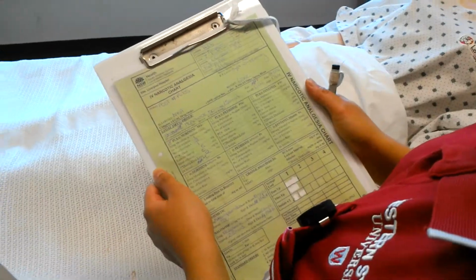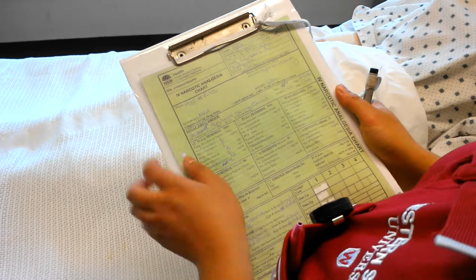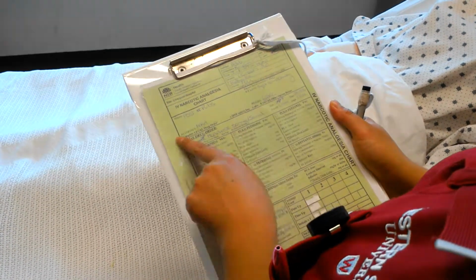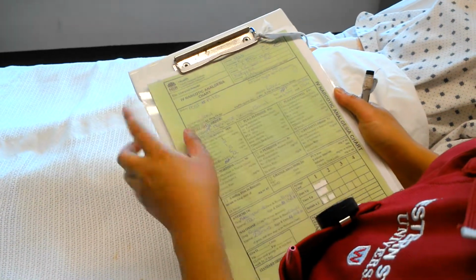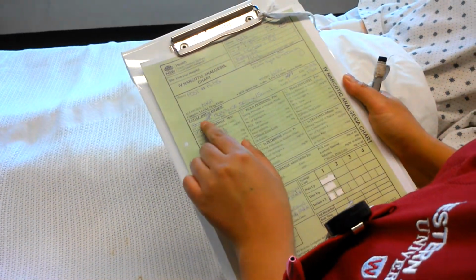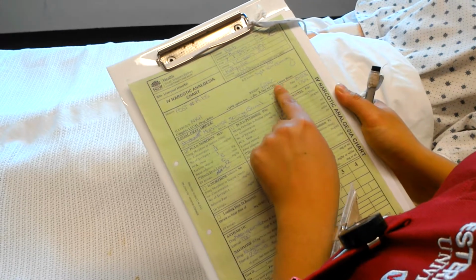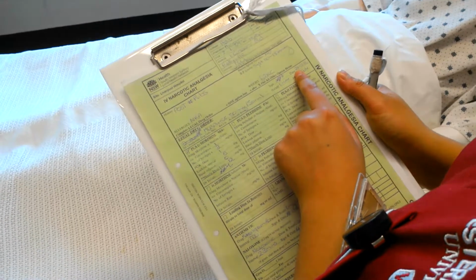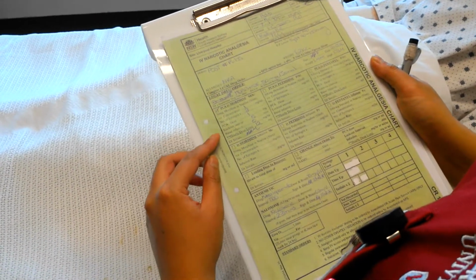And second nurse, do you mind validating the order with me? Yeah. So I've got patient Miriam Adib, date of birth 7th of the 1st, 1969, MRN is 174963. She's got nil known allergies. This is an IV narcotic analgesia chart. It's going to be given for her post-fractured ribs. So the order is for morphine 50 milligrams in 50 mils. It's been signed by the doctor with the name printed. The date is within 7 days, so it's still valid for me to use it. The criteria has been listed as well.